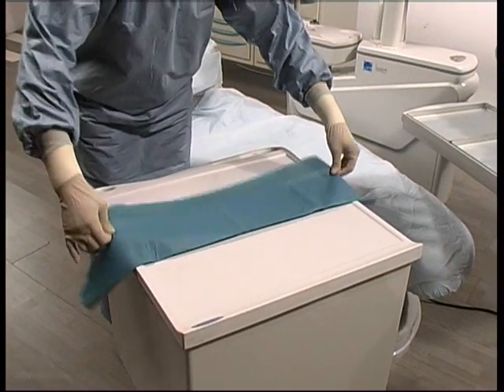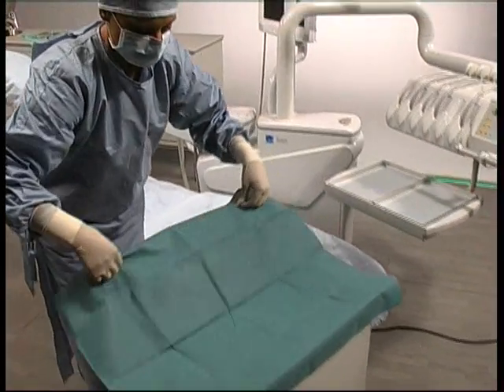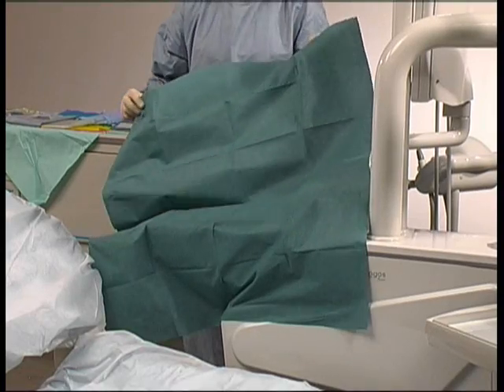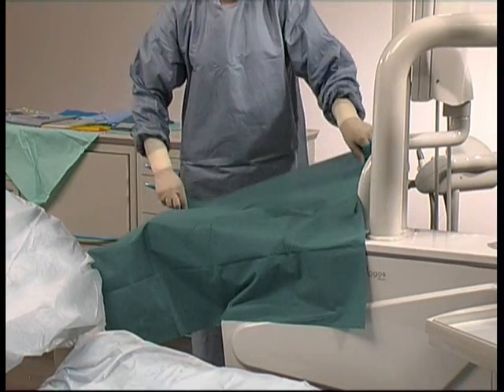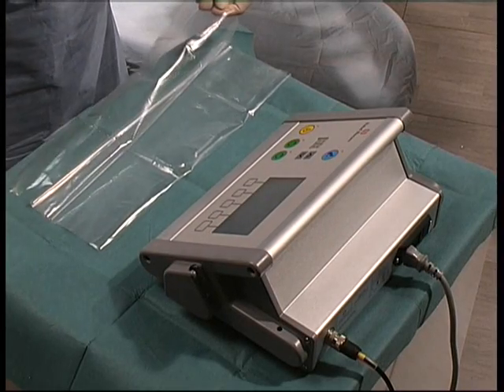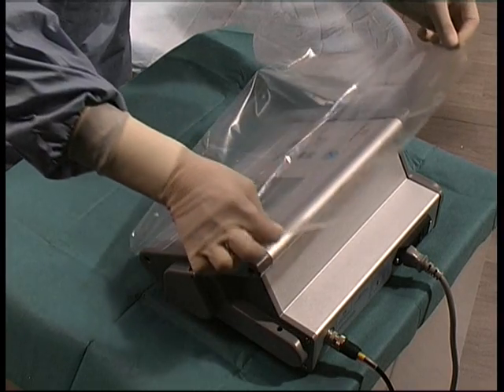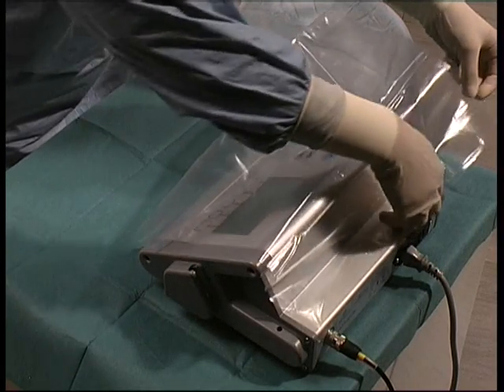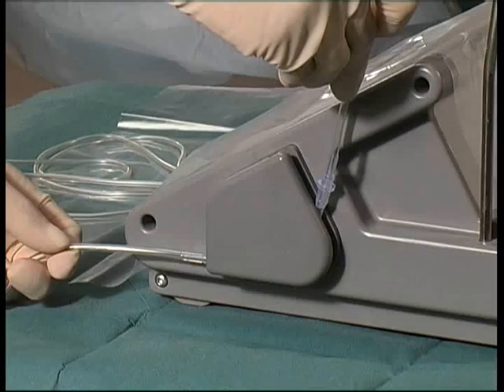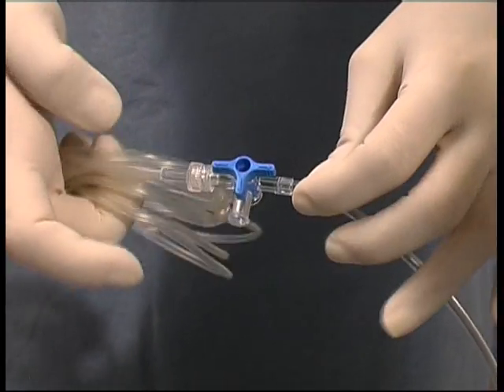The cloth is adhesive to avoid accidental movements during the operation. The absorbent side stops the spread of any contaminated liquids. Using a transparent waterproof adhesive drape, she isolates the physio dispenser and prepares the cooling systems. She inserts the infusion tubing with drip adjuster into the peristaltic pump and connects the pipe to the terminals of the micromotor, fixing it with clips.